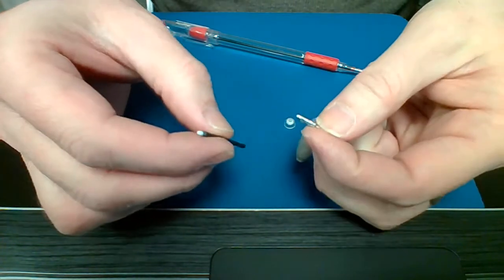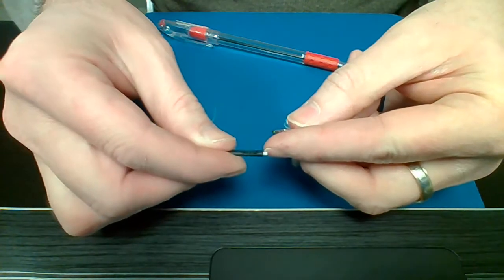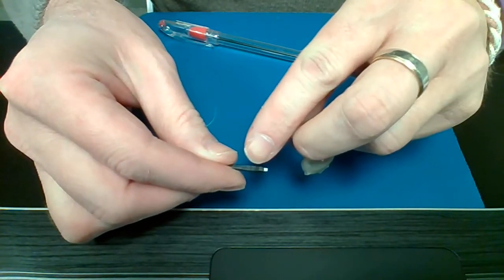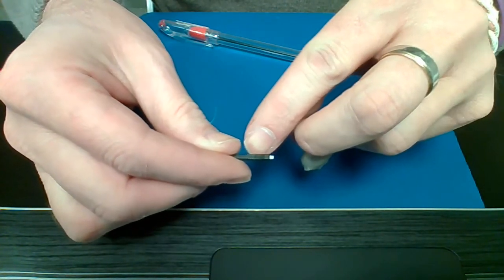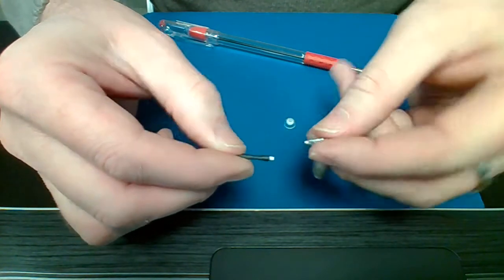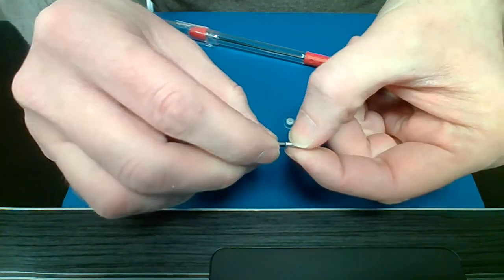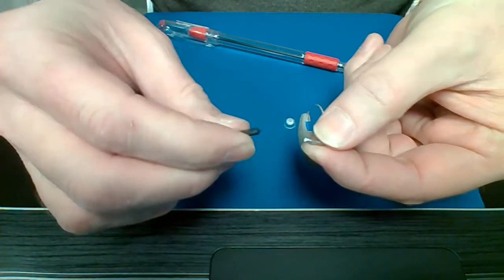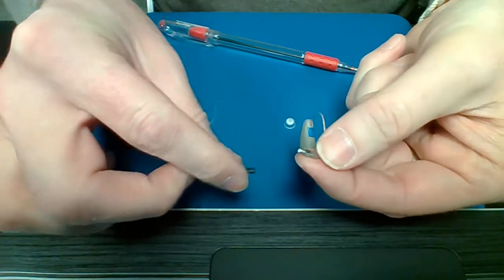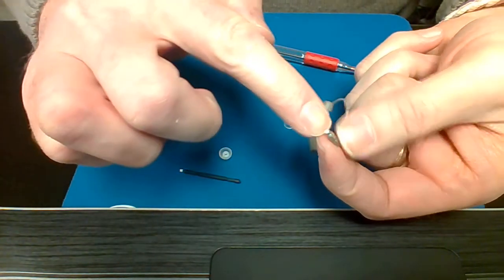You want to turn the stick over to the new side. Okay, the new side has a little plus on it. It's kind of hard to see, but you can magnify it there and see that. You take this part and you just push the new filter back in, give it about a half a turn, and pull it right off. Okay, that replaces the wax filter in there.